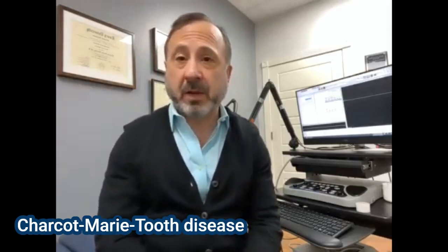Some of them have specific names. Maybe you know someone who has a condition called Charcot-Marie-Tooth disease, also sometimes called hereditary sensory motor neuropathy. This is an inherited form of neuropathy. It's actually not all that uncommon. I have some patients with Charcot-Marie-Tooth disease, and you can detect that on nerve conduction testing. I'm going to wrap this up really soon, but I do want to talk about the electromyography component.